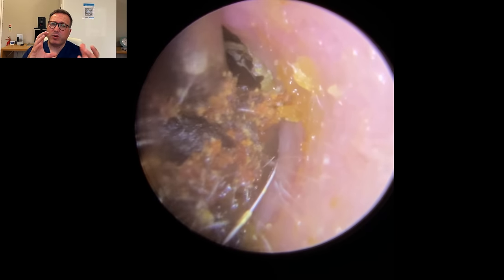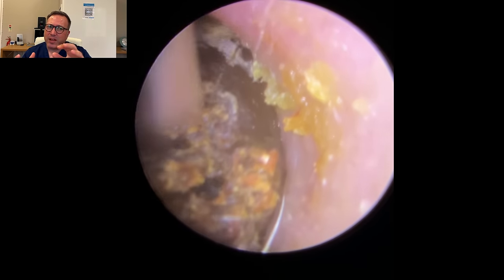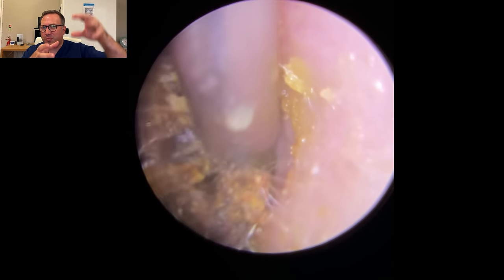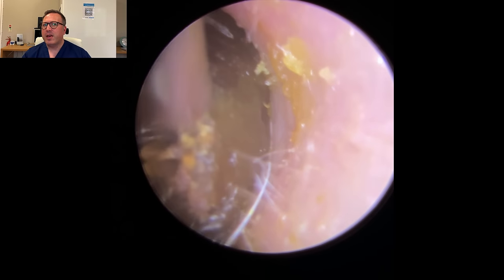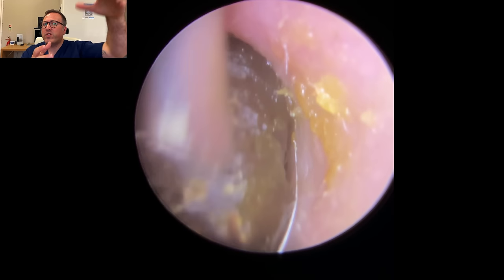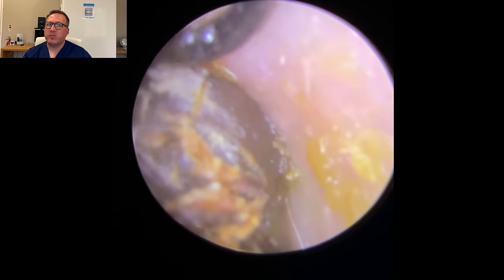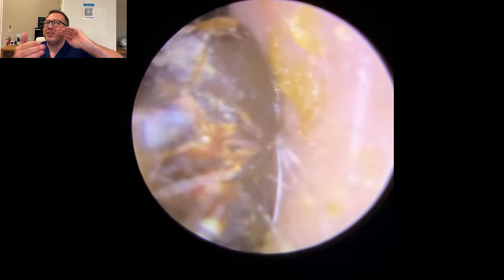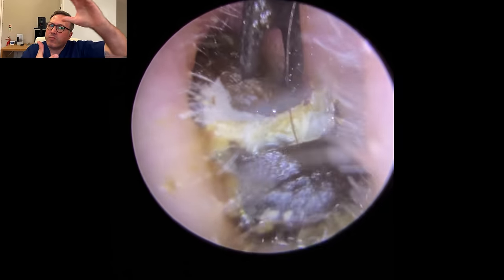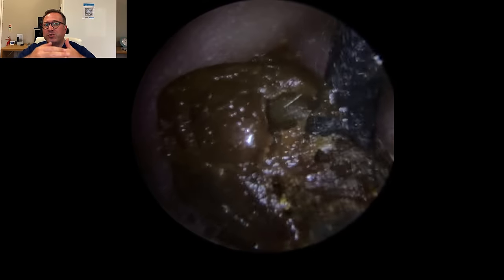Really awkward shape because it's perfectly formed to the shape of the canal. You can see there's a little white dry skin layer at the top - I'm aiming for the smoother section because we've got a better chance to get a good grip. I'm using that slight wiggling, slight depression motion just to draw this down and turn the wax. Because if we can turn it to get the smoother side on the outside, or even drop it far enough to get the rear end of the wax under the entrance to the canal, it's going to be a lot easier to pull forwards. It's wedged there now. Because we've wedged it, we can just get over the top, use that harder outer layer as a fulcrum almost, and then bring this down. So we've actually managed to turn the wax through 90 degrees and then flick it on its head - turn it 180 degrees.